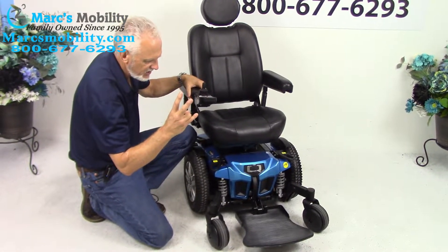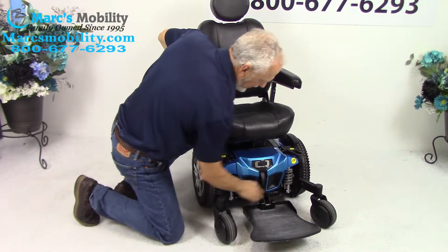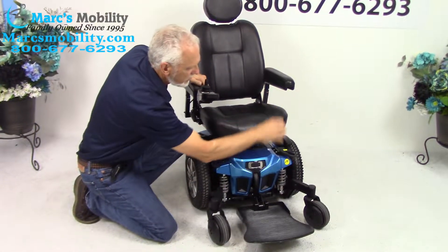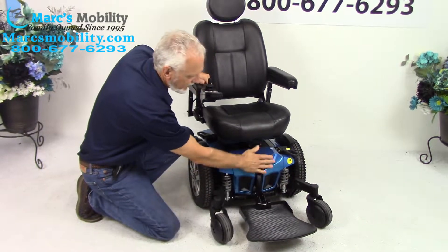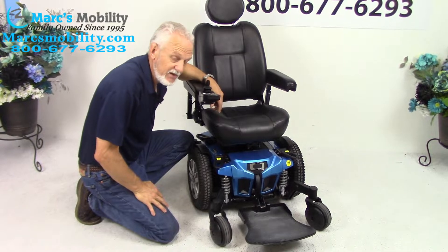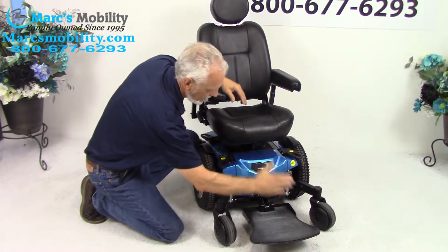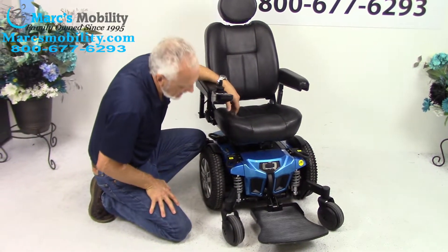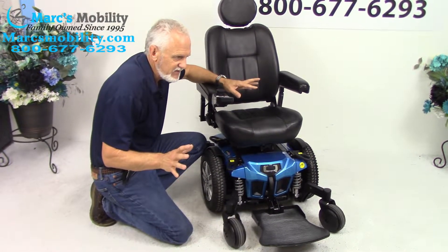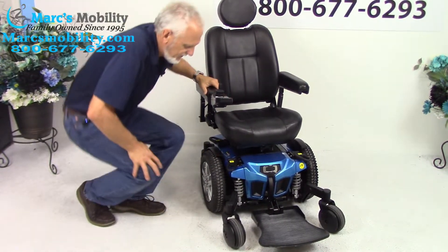There are two batteries in this chair and they come out from the front. There are two levers in the front — squeeze them in, grab the bar right here, and pull the whole cover. The whole front end will come out and the batteries come out from the front. There are two of them — they're 55 amp batteries. This is where you would replace them; you don't have to take the whole chair apart, just take the front end off. These batteries will give you about 15 miles on a battery charge, depending on the weight of the user and terrain.